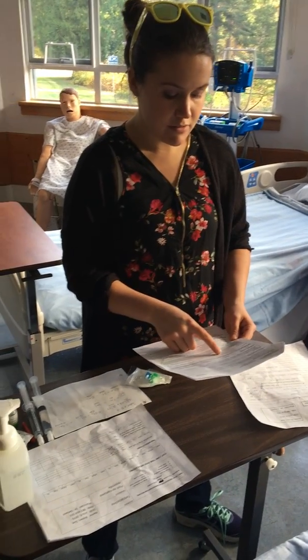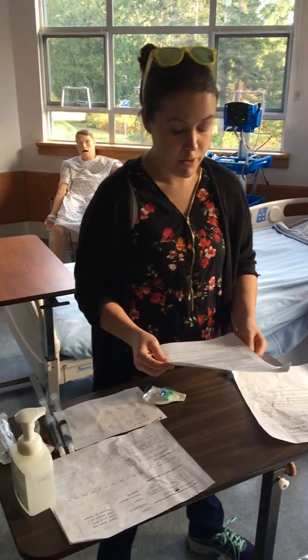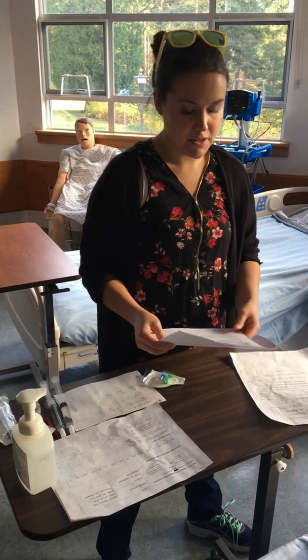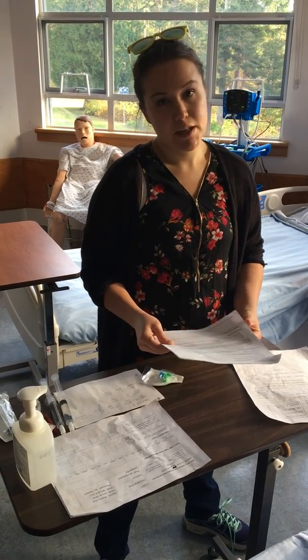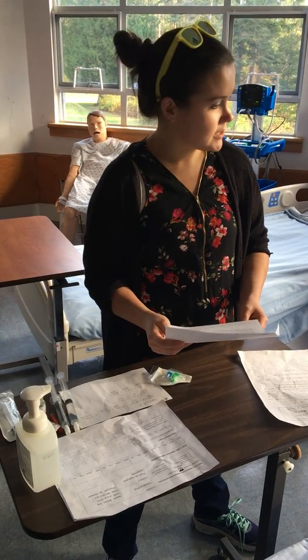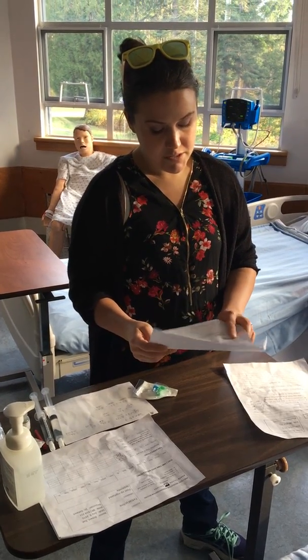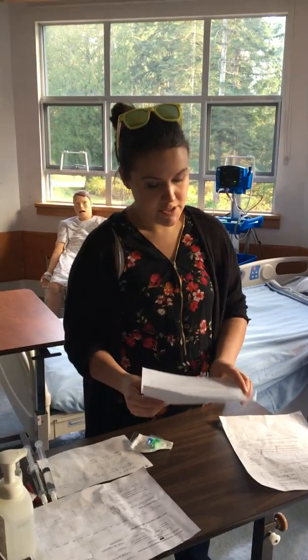with normal saline, 1 milligram of medication, and 1 milliliter of medication, 9 milliliters of normal saline. And I'm going to give it over 30 seconds. And so then I'm just going to check that it's stable in normal saline, because the client has a running IV of normal saline, and it is.